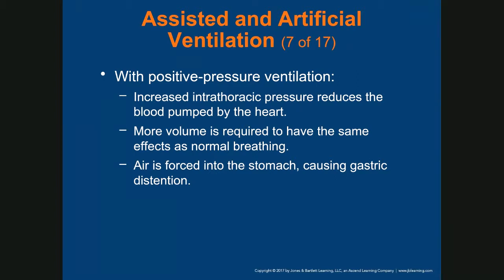Now, whoever is in charge of the BVM, you need to pay attention to what you're doing, right? So I can be at the head bagging the patient and I am looking to my left and right and watching what other people are doing and squeezing the bag. If I am doing that, I don't know how many squeezes are giving me chest rise because I'm not paying attention to that, right? So you need to ensure that when you squeeze your BVM or you're using a pocket mask, you see chest rise.